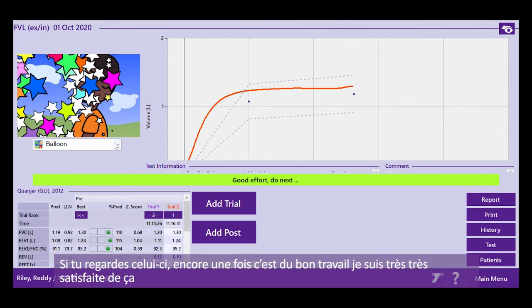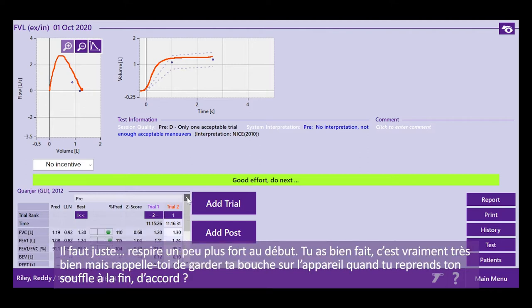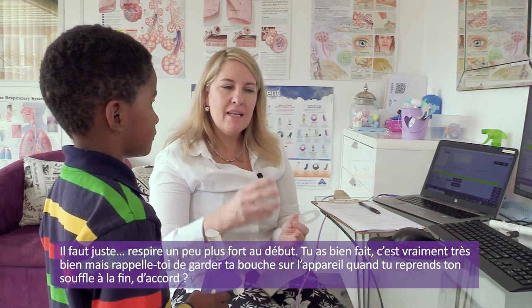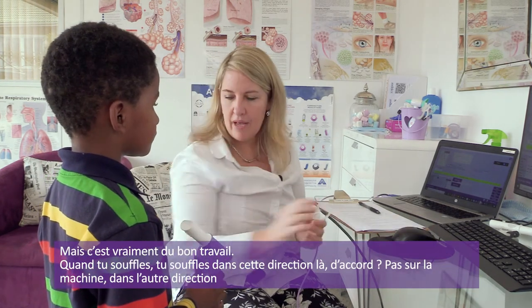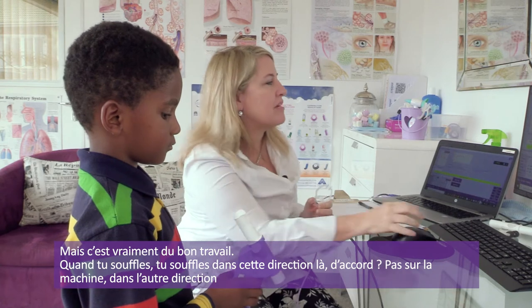Okay, so if you look at this one, again, you did a really, really good job there. I'm very, very happy with that. We just need you to breathe a little bit faster in the beginning. You did well. This is really very good. But again, keep your mouth on the machine when you breathe in at the end. Okay. All right. It's looking really nice. Okay. So when you blow, I just want you to make sure that you blow that way. All right. Don't blow towards the machine. Just blow in the other direction.